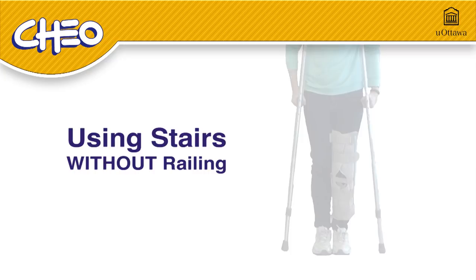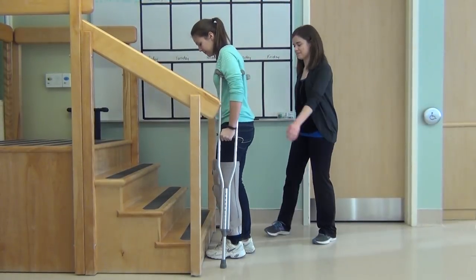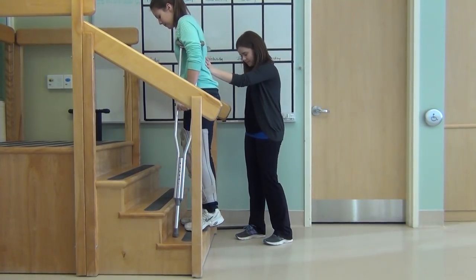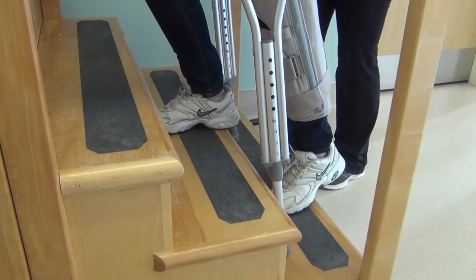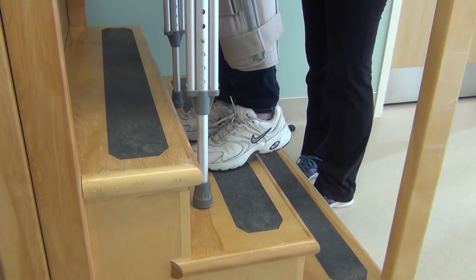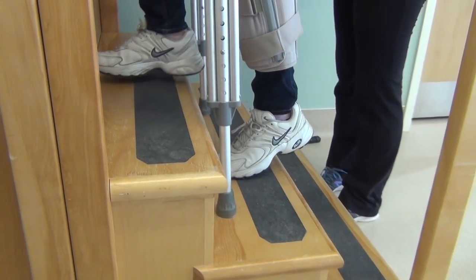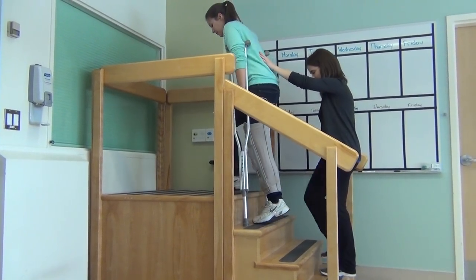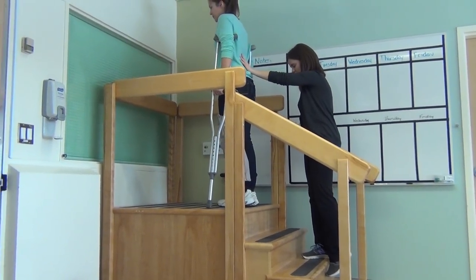Using the stairs without railing. Limit your time on the stairs during the day. An adult should be there to make sure the child can safely climb the stairs. This time you'll be using both of your crutches. When going up, start close to the bottom stair. Push hard on your crutch handles and step with your good leg onto the first stair. Follow with your crutches and step up with your injured leg. You can put your injured leg on the stair to regain balance if needed. Remember, when going up, your good leg goes first.